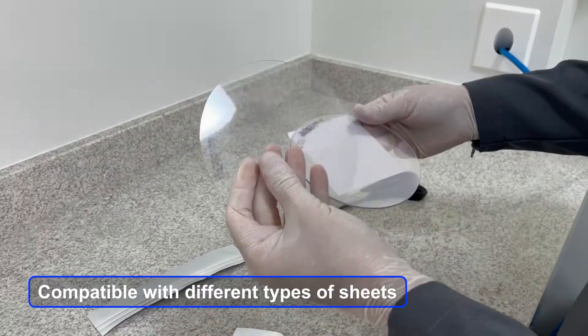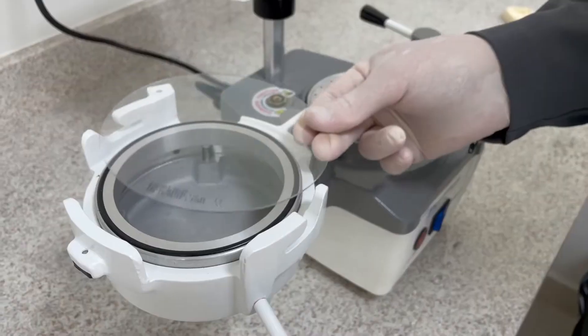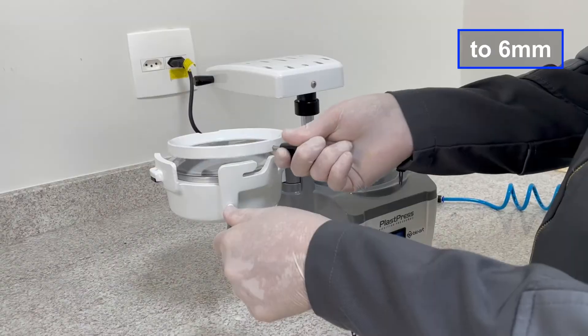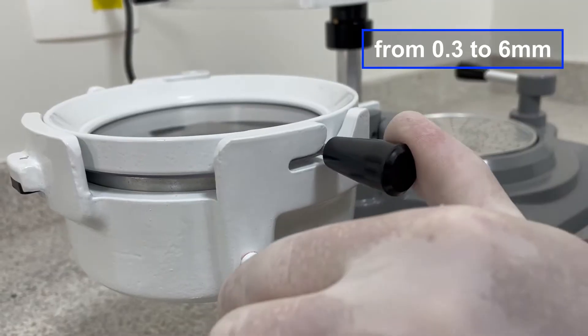Compatible with different types of sheets for round and square shapes, rigid and flexible from 0.3 to 6 millimeters.